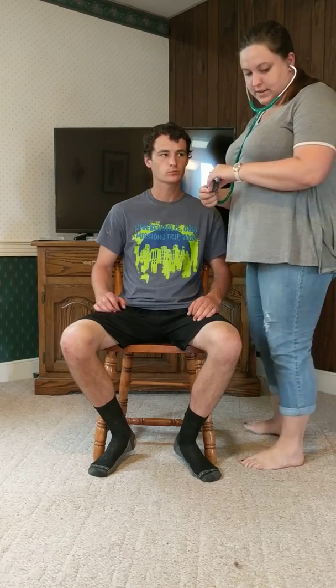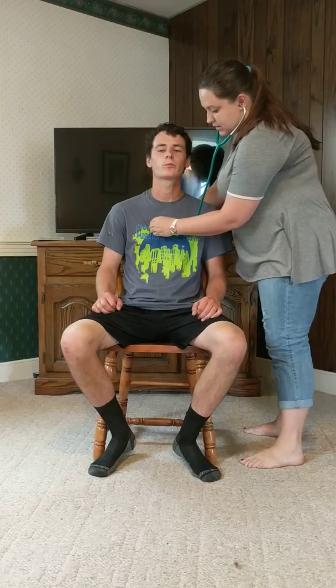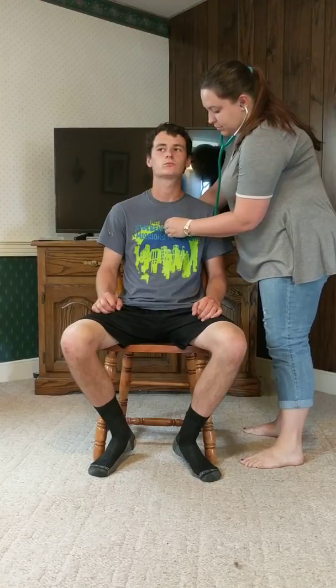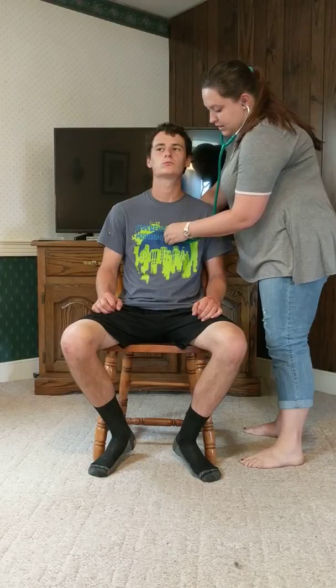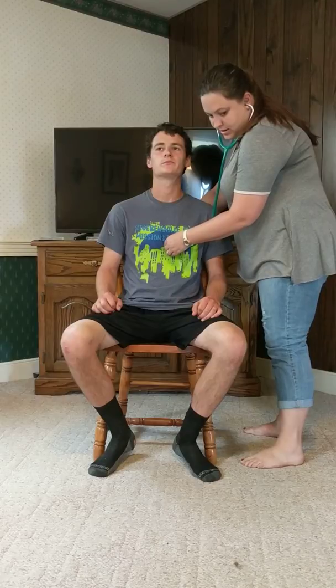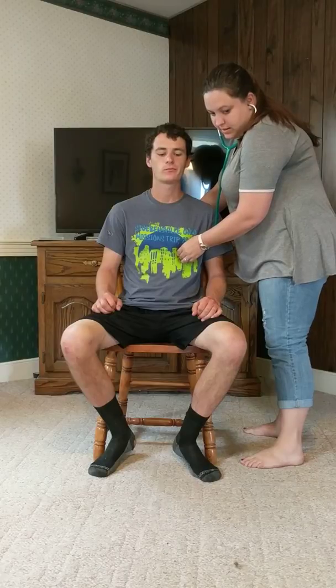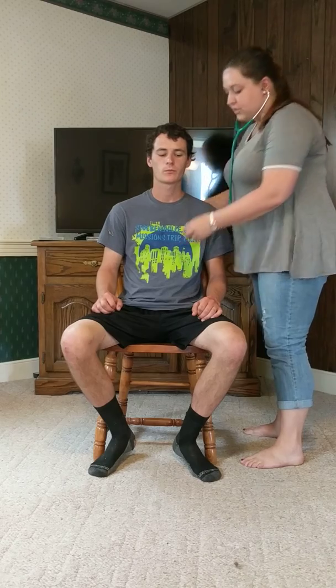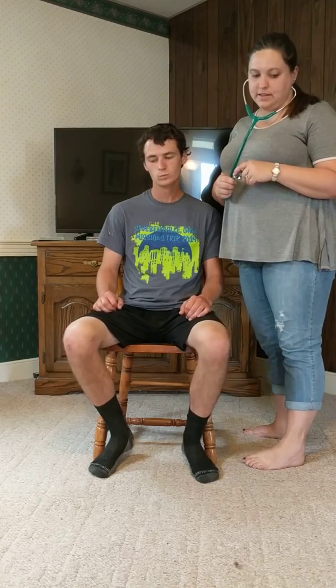First one is the aortic valve. Second is pulmonic. Then Erb's point. Tricuspid. And mitral. S1 and S2 are best heard at the apex of the heart, and now I'm going to listen with the bell.